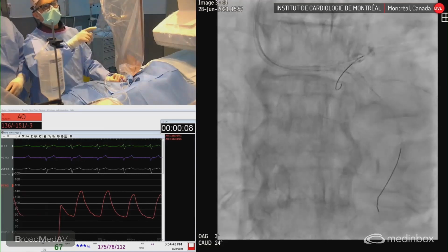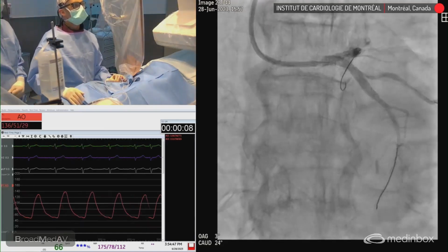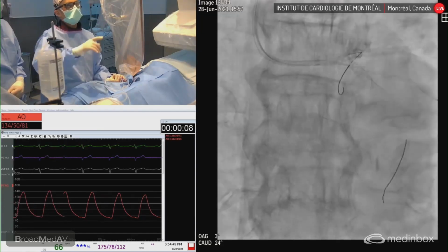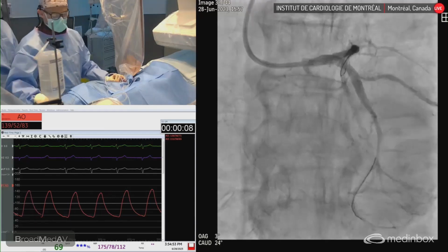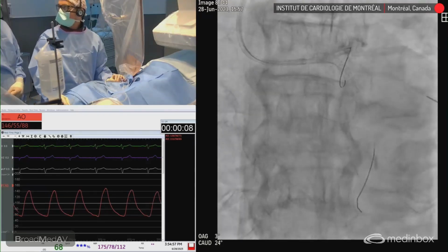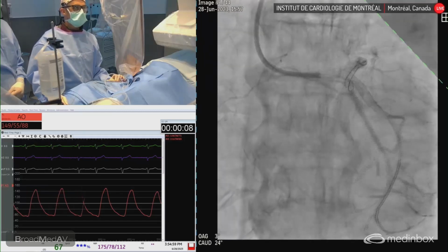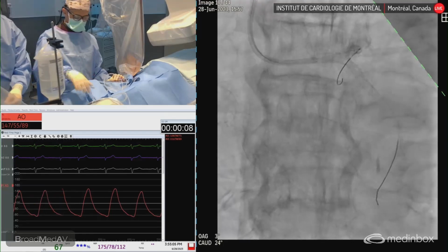Good. So that's interesting. Actually, I don't think we need to cover more distally. No, maybe not. It looks good. We'll see with IVUS. The flow in the LAD is a bit slow. 10-40. Let's just go see 10-40, what's going on in the LAD, just because I wonder if it's me or if the flow is slow. No. But we'll see in this 40.